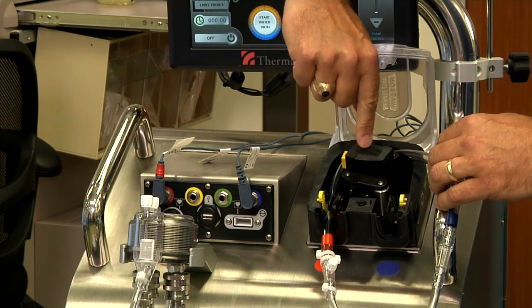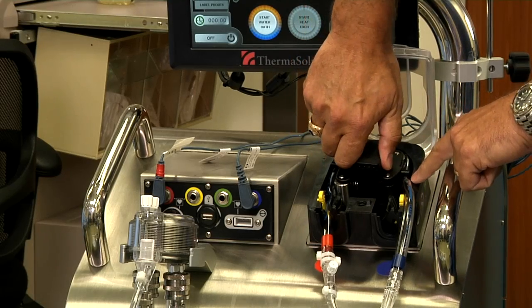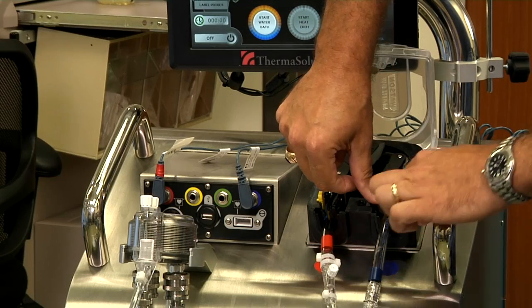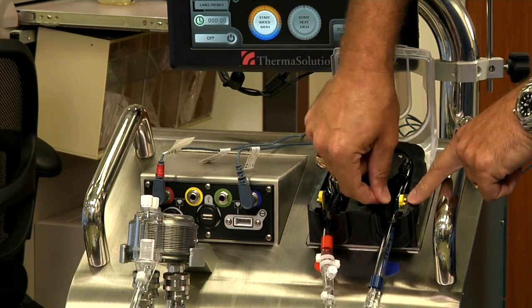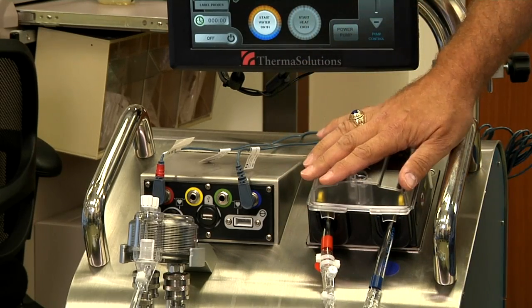There is a knob to twist the pump head and it will self-thread the tubing. At the end, remember to place the tubing through the other spring clamp. The door is shut and the tubing is now assembled on the pump.